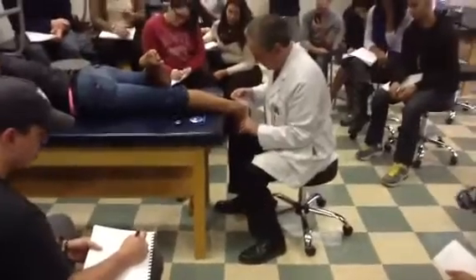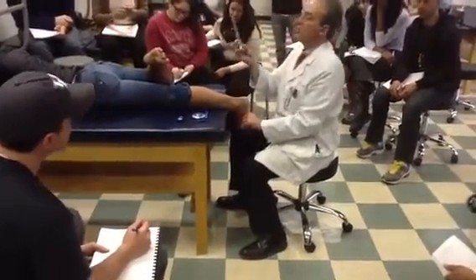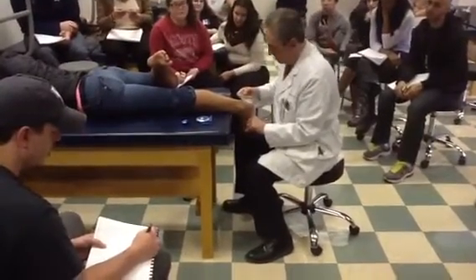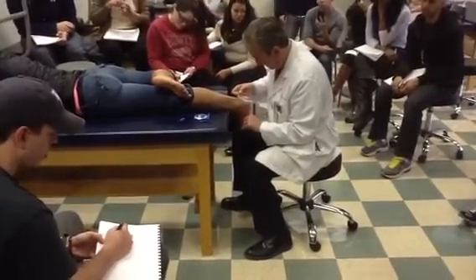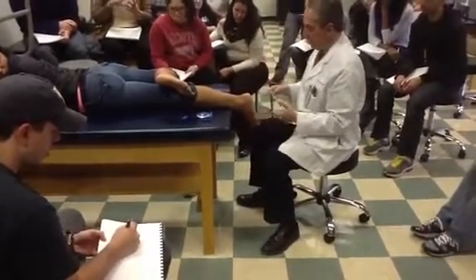But then, this is the harder part. You have to try and visualize or see the plantar plane of the metatarsal heads and line up your protractor with that. Okay? So you find your bisection, take your protractor, line it up with the plantar plane of the metatarsal heads. Hopefully you get a good measurement. Okay? But that's hard. So here's the way I like to do it.